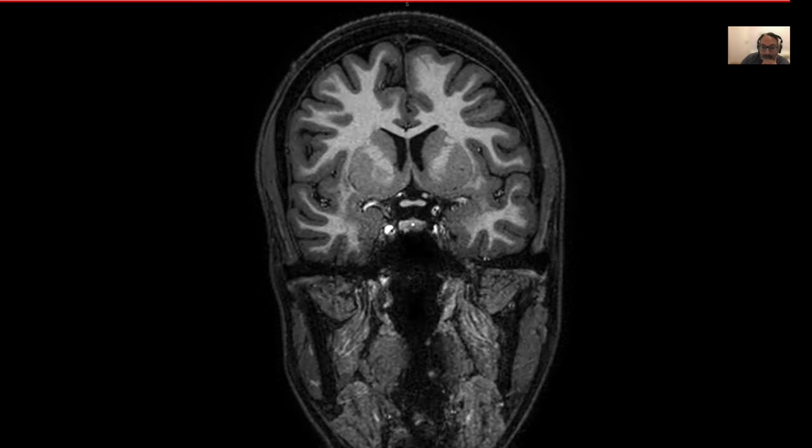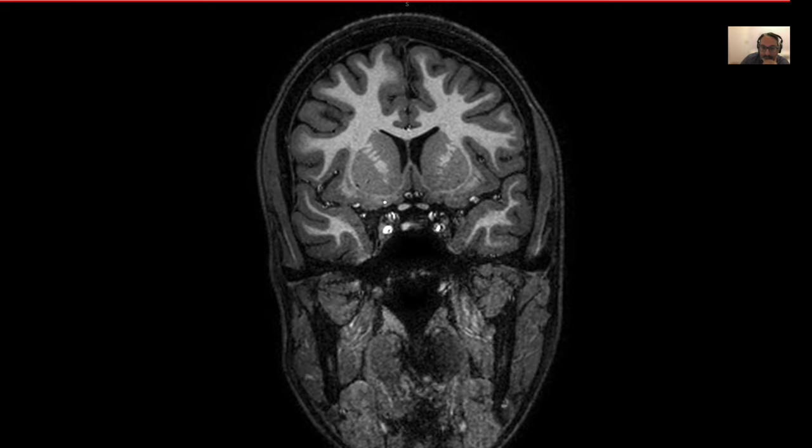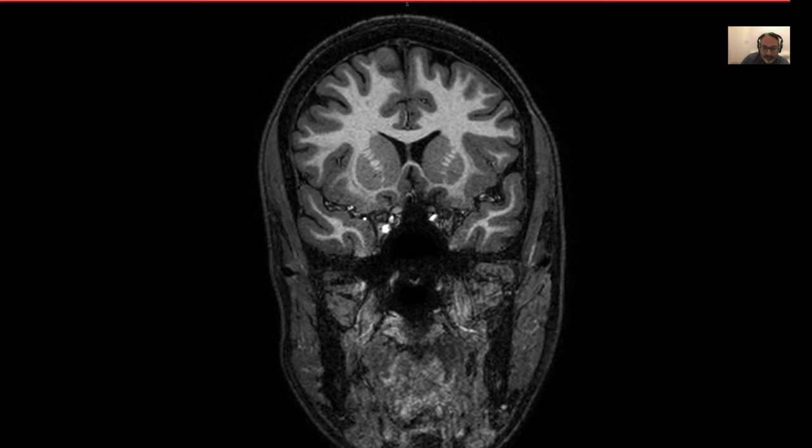And another important thing, now that you know where you are, is where your circle of Willis is. So if you look here, this is where your middle cerebral arteries are.